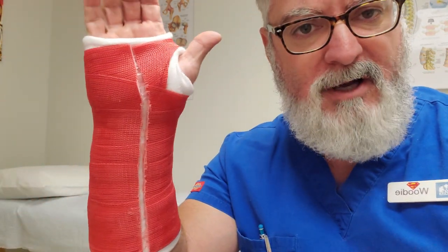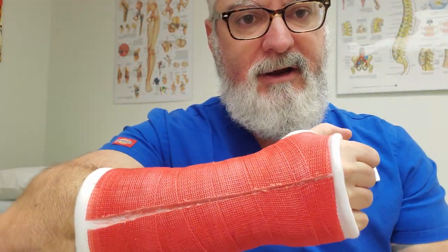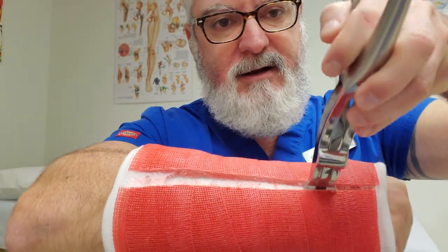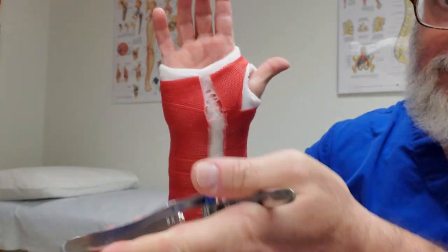For time purposes, I'm going to pause for just a moment, cut the other side, and then move on to the next step. As you saw, I cut the medial side of the cast midline, and during the pause I went ahead and cut the lateral side as well. Let me grab the spreaders — these are cast spreaders and should be attached to the unit. You place them inside and just give it a little spread. When operated correctly, you should never go through the cotton and accidentally scrape your patient, whether adult or pediatric.